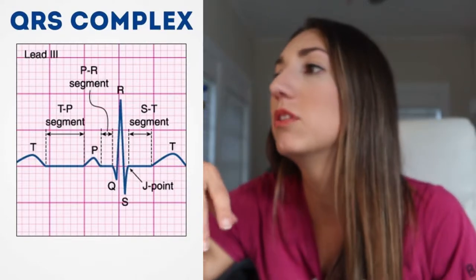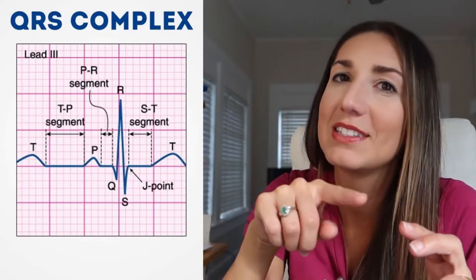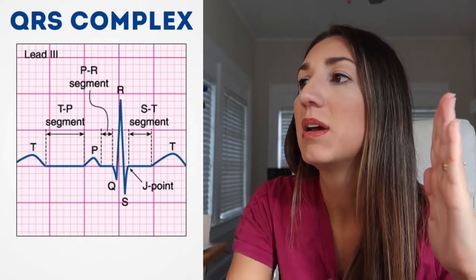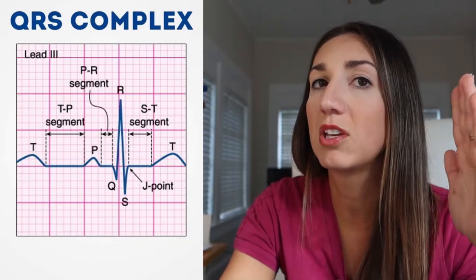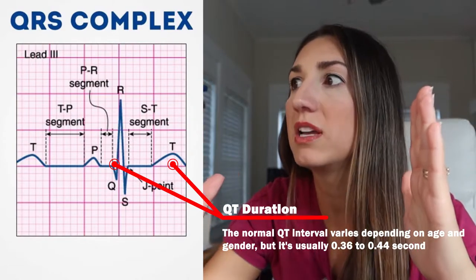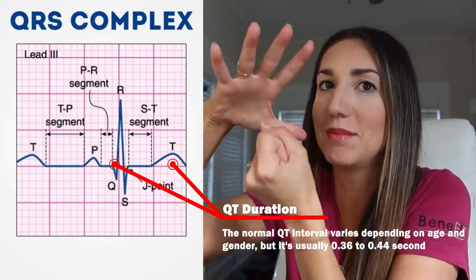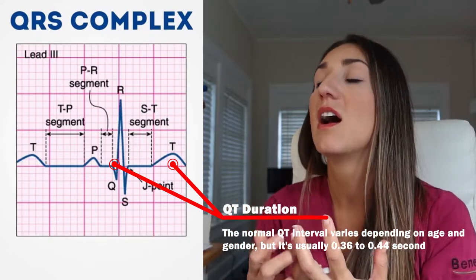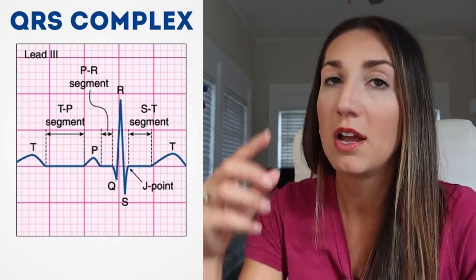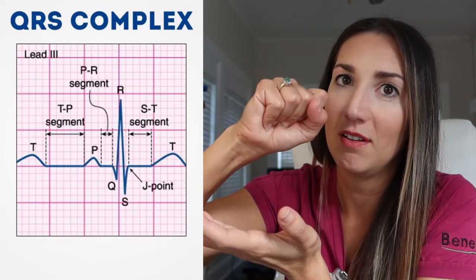And then the ventricle repolarization is the little T. Some people say there's a TU wave, but really just worry about the T. Now the Q, remember, was that first blip, and the QT interval, so the time from the Q through repolarization, should be 0.36 to 0.44 seconds. So these are fractions of a second, because remember your heart's going bop, bop, bop, bop, bop. But we measure these on an EKG because we want to make sure that the chambers are behaving correctly, that there is atrium, ventricle, atrium, ventricle. And it's not like atrium, atrium, ventricle.